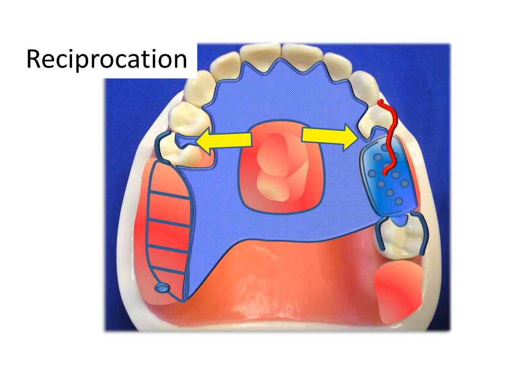With number 15, we keep it simple with a circumferential clasp, recalling how important it is to locate these elements in the middle 1/3 and avoiding occlusal interference. Dr. Goon, that's about all the time we have. I think we've covered this design. Are there any final comments for our audience?